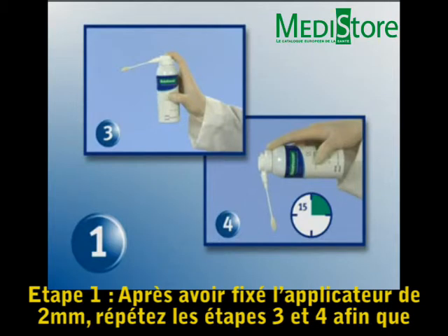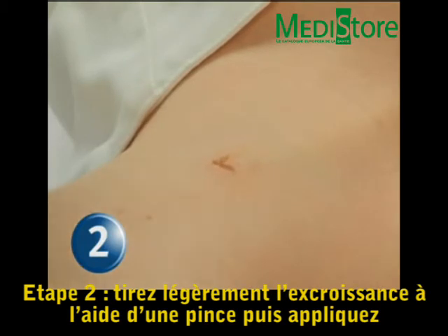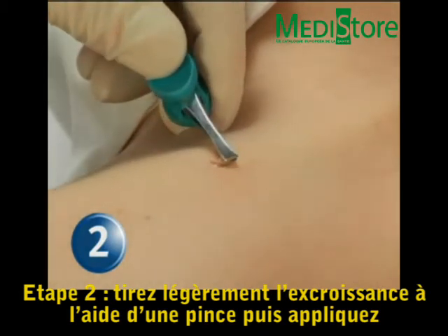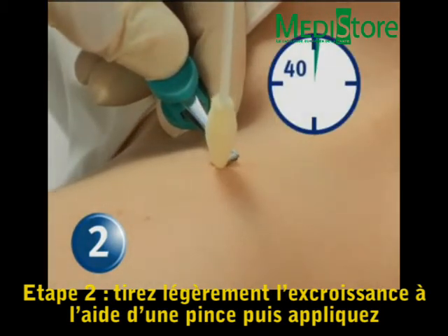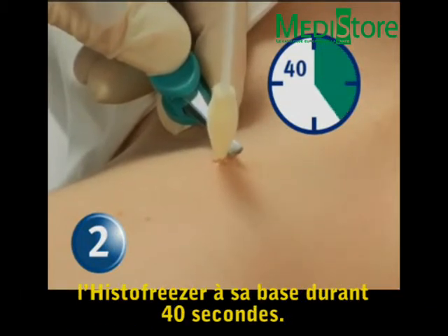Step 1: With the 2 mm HistoFreezer applicator installed, repeat steps 3 and 4 to bring the applicator to the effective temperature. Step 2: Grasp the skin tag with tweezers and gently pull it away from the base. Place and continuously apply the applicator tip to the skin tag base for 40 seconds.